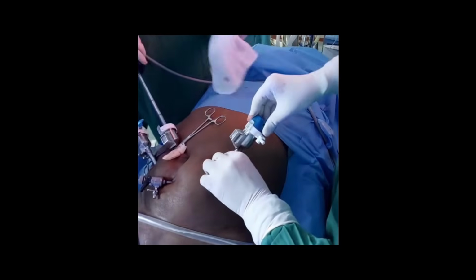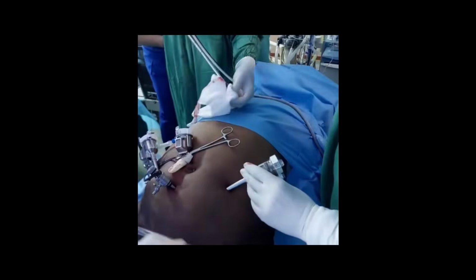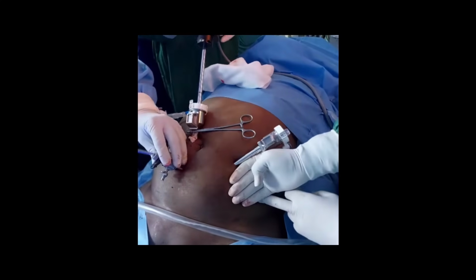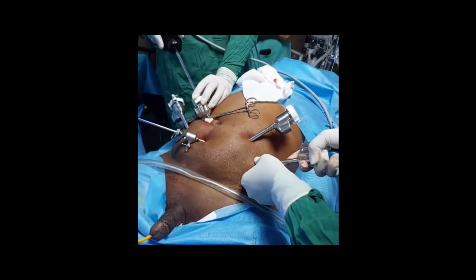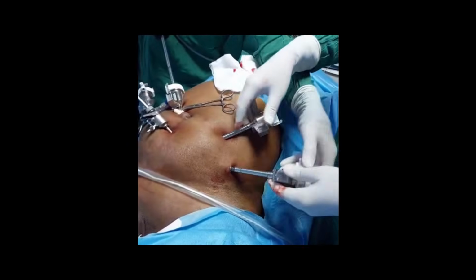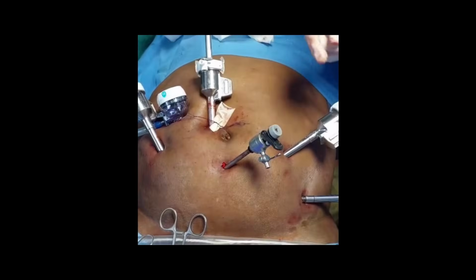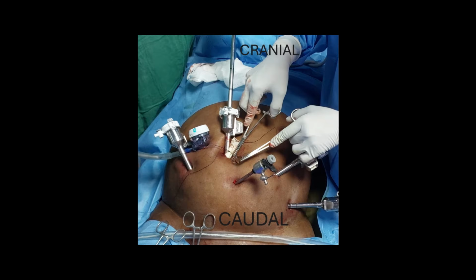Then a midline incision can be made and a 5 mm laparoscopic trocar placed, and on either side you can drop down the peritoneum and place the four ports. The assistant port can be made between the camera and the first right side or left side port. And the fourth arm can be made between the inferior epigastric artery and the peritoneum covering the gonadal vessels. That will be the fourth arm.